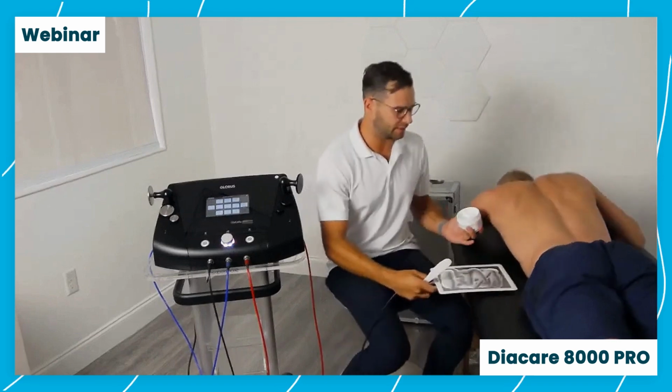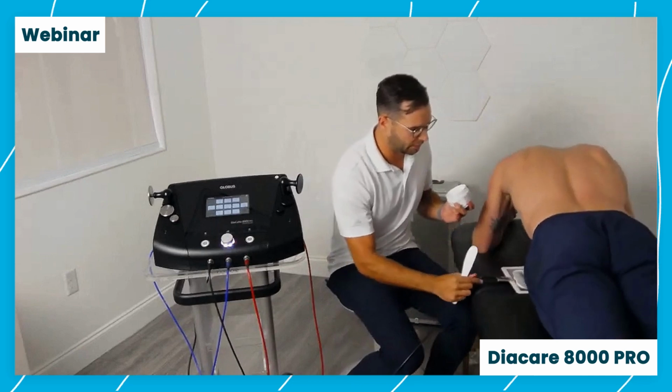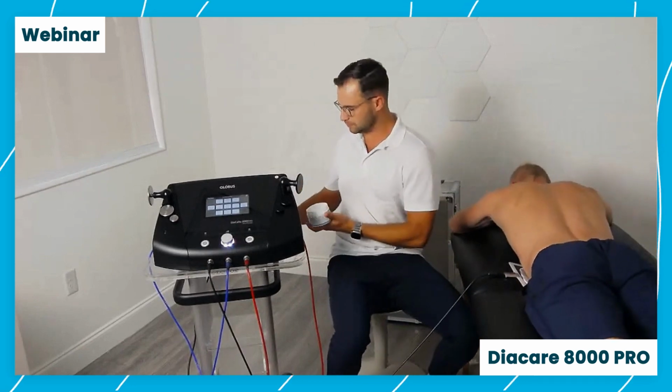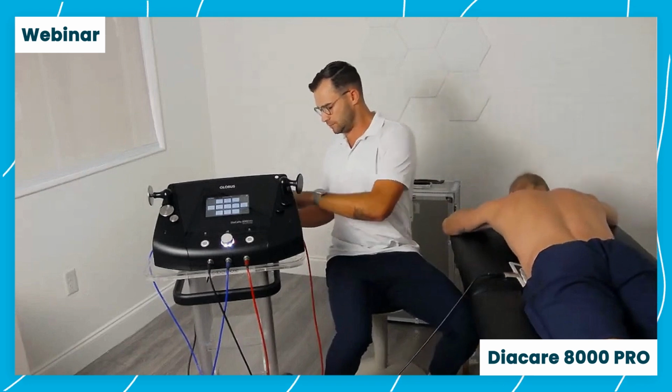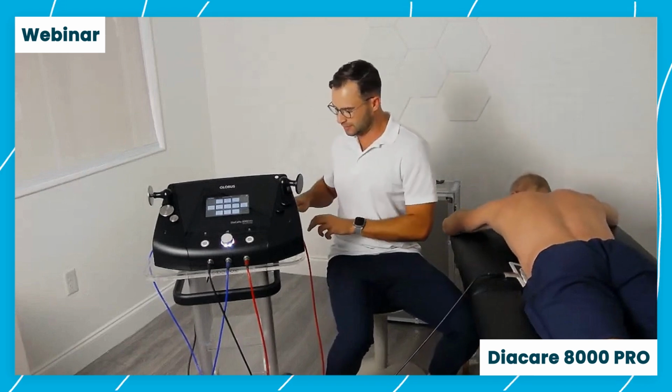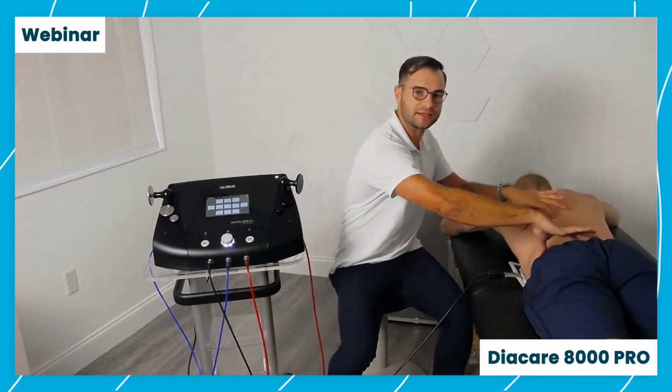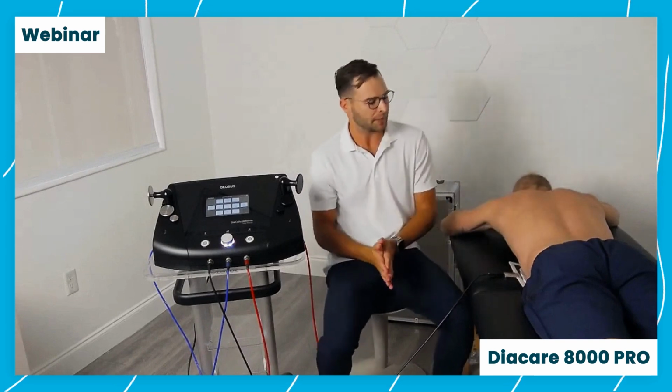And we place it underneath the patient. So for Fabio, we're going to be placing it in his left lower quadrant. Because that treatment area, as we talked about, is going to be this left lower side of his body, left lower side of his back, rather.